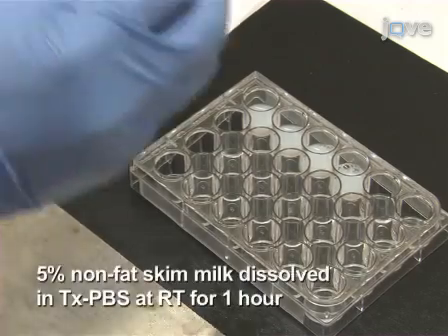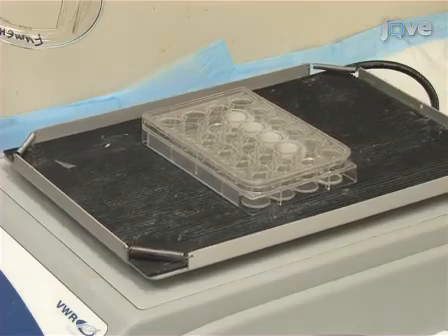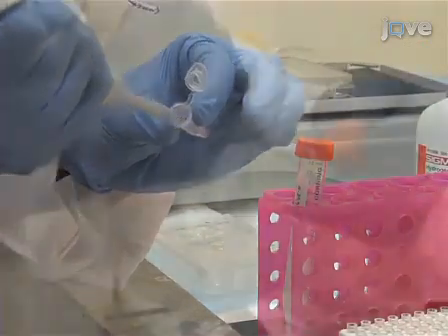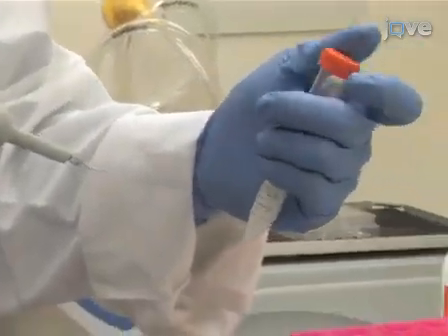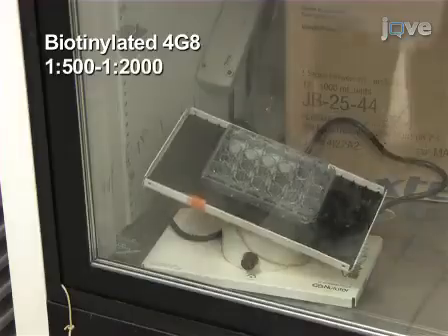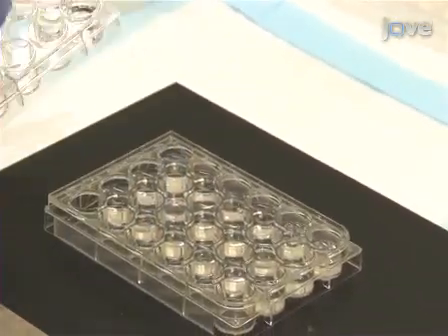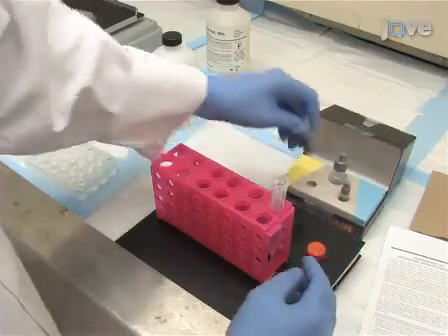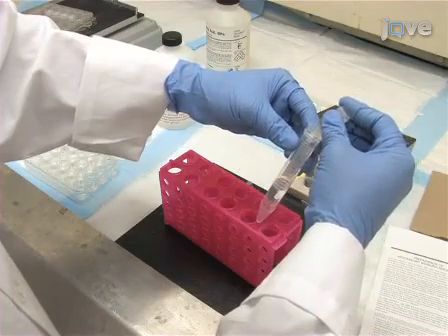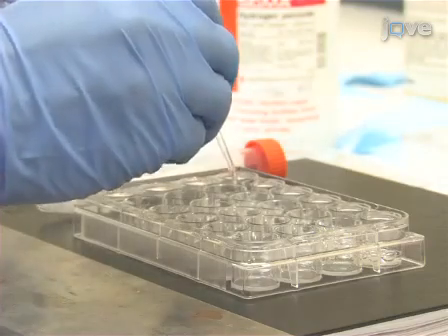Block sections with 5% non-fat skim milk dissolved in Triton X PBS at room temperature for 1 hour with gentle shaking. Continue to incubate sections in primary antibody diluted in Triton X PBS containing 5% milk at 4 degrees Celsius overnight with gentle shaking. Wash the samples 3 times with Triton X PBS for 10 minutes. Now prepare ABC solution according to the manufacturer's protocol and incubate sections in the ABC mixture for 30 minutes with gentle shaking, followed by 3 washes with Triton X PBS for 10 minutes.